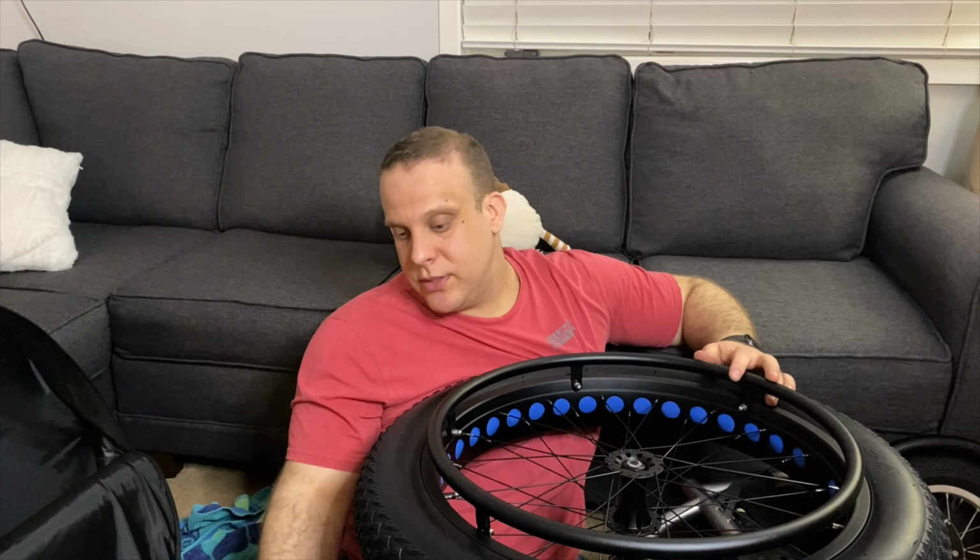So see now, it's tight, but we made it, and we have the spacing that we need. Here it's not rubbing at all, and because we have that spacer, the wheel's far enough out that we're not going to rub there either. So I'm just going to do the opposite to the other side, get the other wheel on, and I'll show you how it looks. We'll go from there.